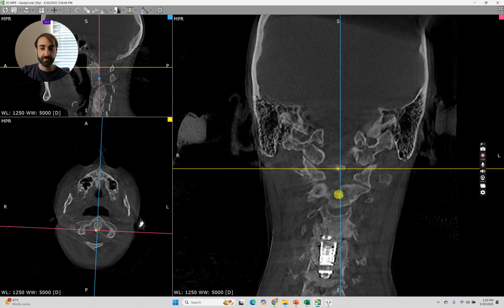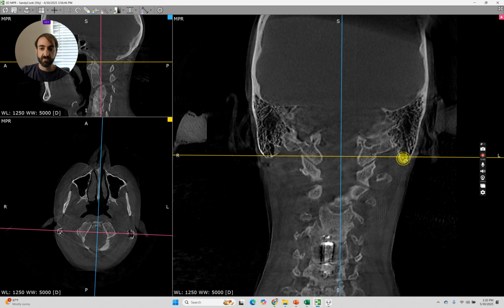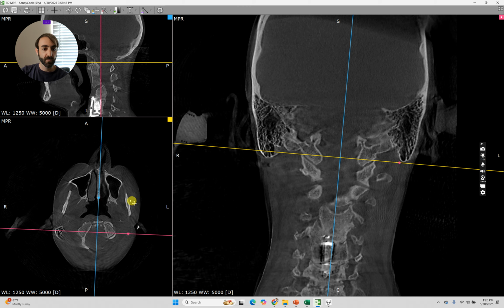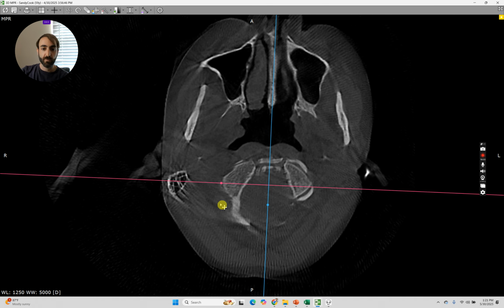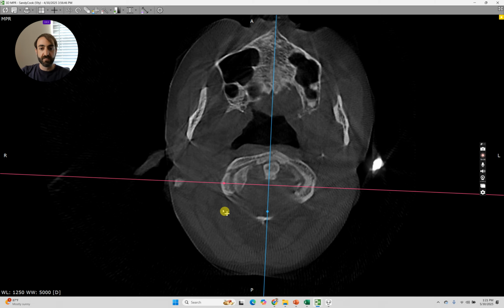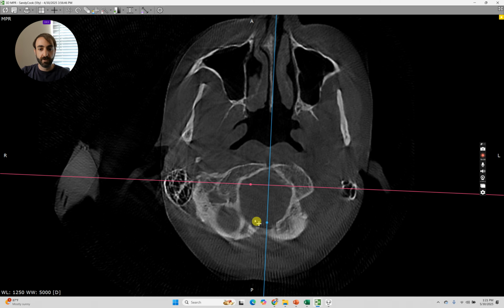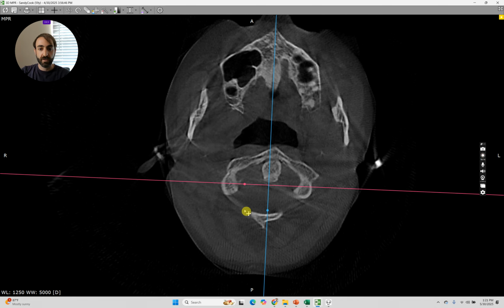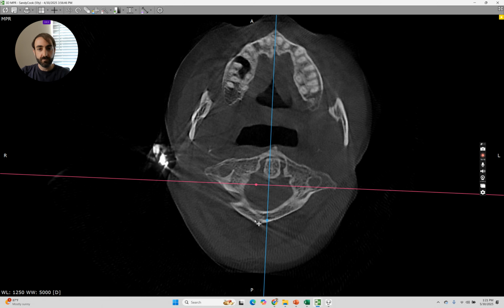And once we have that, then I scroll towards my atlas, and I'm going to position this more to sit on top of that atlas like that. And that way, as I start to look at this horizontal slice, and we start to come down into that atlas area, and you see the condyles of the skull right here, foramen magnum, we come a little bit lower, lower, lower, and we see that atlas starting to appear and jump out at us right there.